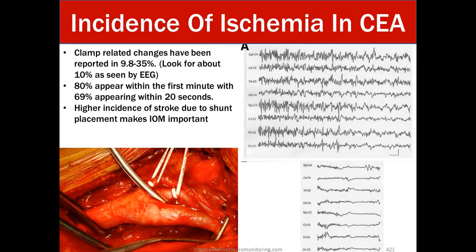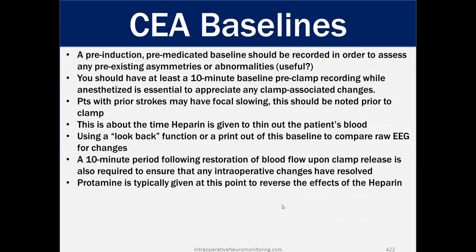This is a picture of the actual procedure where they put some tie loops around and then put their clamp on. Carotid baselines: a pre-induction, pre-medicated baseline should be recorded in order to assess any pre-existing asymmetries or abnormalities. This is what I stated before, what's in the guidelines. I question its usefulness, but for the test, that's what the guidelines say.